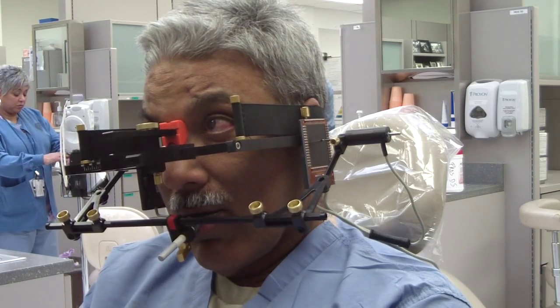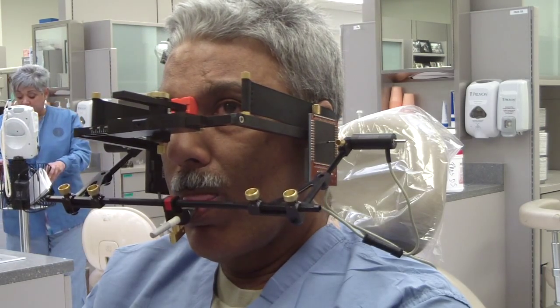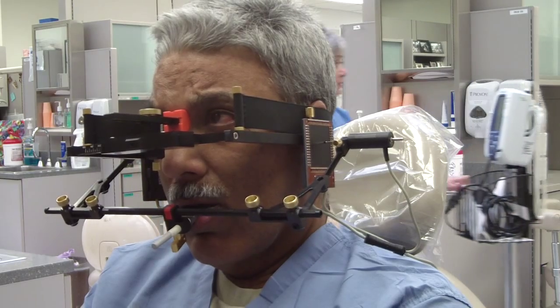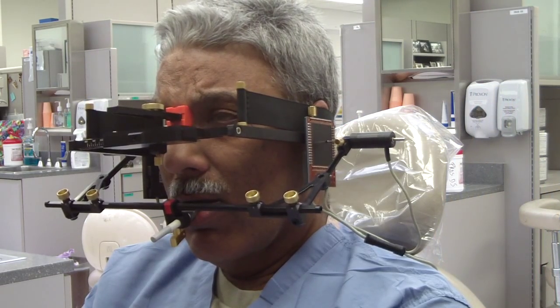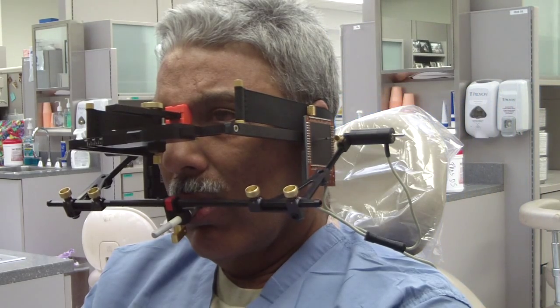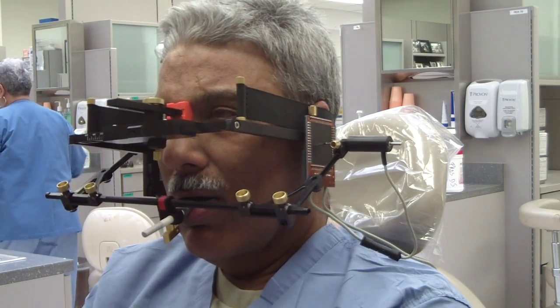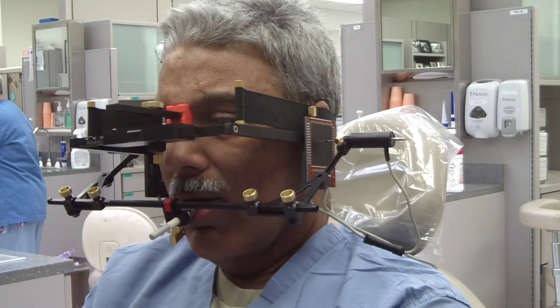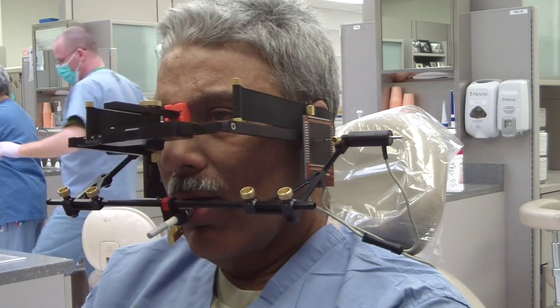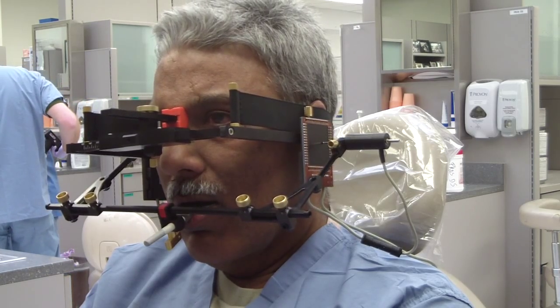It tells us whether the patient has an immediate side shift, because that is very important when it comes to a full mouth rehab. Immediate mandibular lateral translation — also known as immediate side shift — plays a big role in fabrication of your cusp angle, cusp height, and direction of the grooves as well.